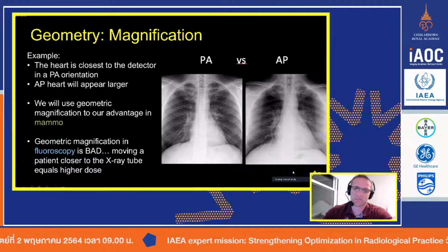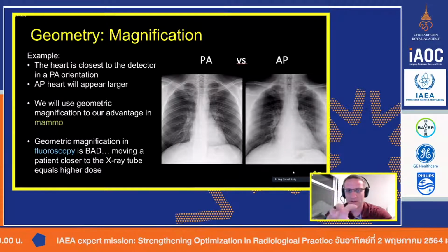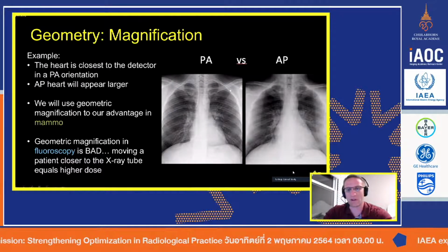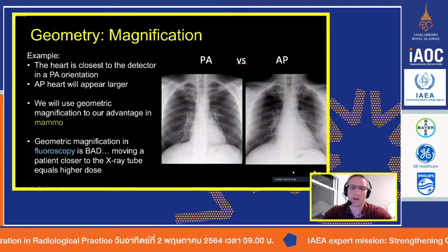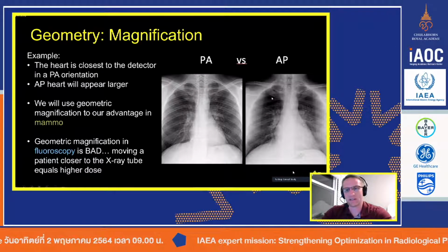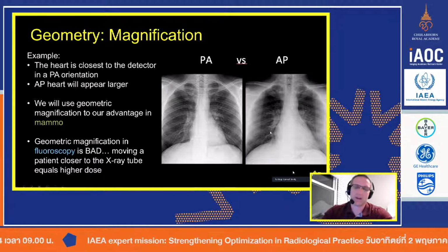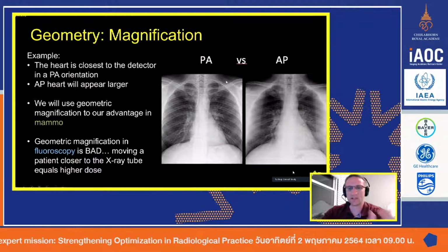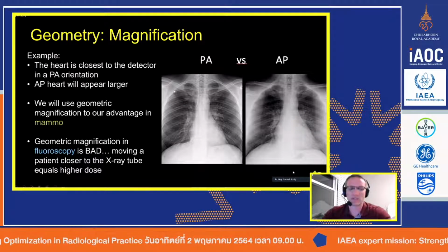And so this is principally why the technologist will place a marker, either a physical lead marker, so it'll appear on the image itself, so the radiologists know the orientation, or they'll digitally make one after they acquire the image. And this is important for the radiologist, though there are telltale signs that this is an AP because you can see the scapula here, but it's always good practice to tell the radiologist the orientation by putting AP, PA, lateral, etc., even though sometimes it's pretty obvious.